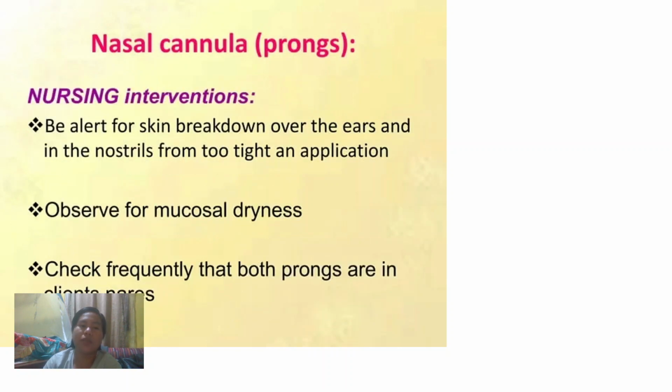Nursing interventions. Be alert for skin breakdown over the ears and in the nostrils from too tight an application. Observe for mucosal dryness. Check frequently that both prongs are in the client's nostrils.